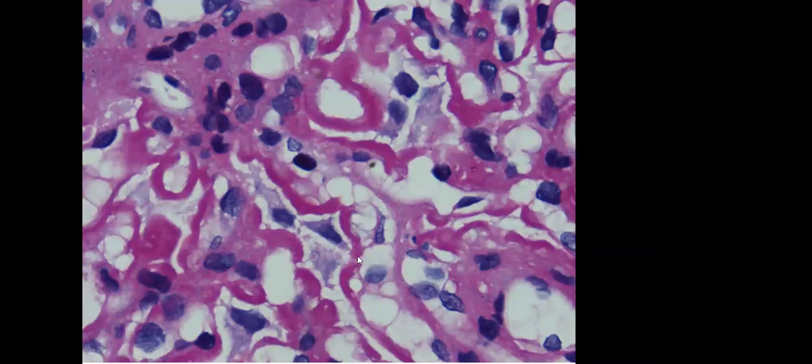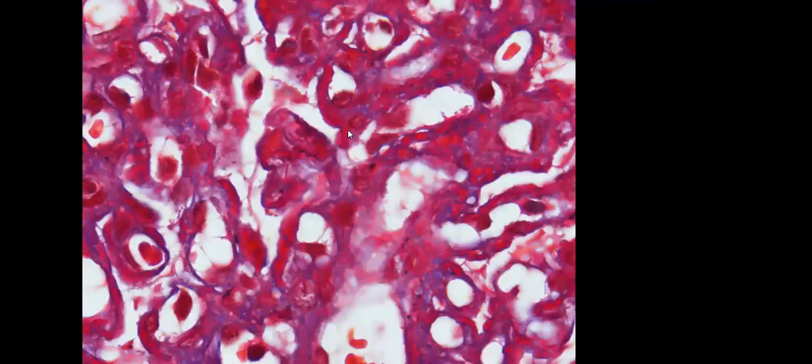There is an interruption of the thickness of the glomerular basement membrane. And just compare this membrane, which is this area of the glomerular capillary basement membrane, which is thin. Okay, so there is thin and thick membrane, and in places the thickness is very significant. And this is a Masson's trichrome stain. When immunofluorescence was not available, people used to do Masson's trichrome stain to demonstrate deposits. So Masson's trichrome stain shows that there are red color deposits along the mesangium and along the glomerular capillary loop.